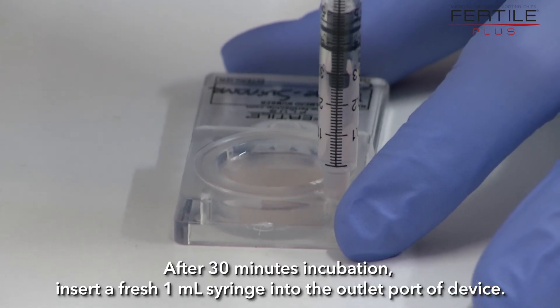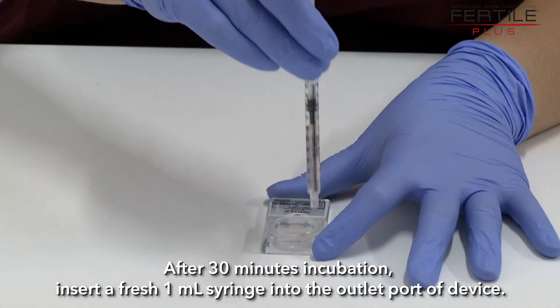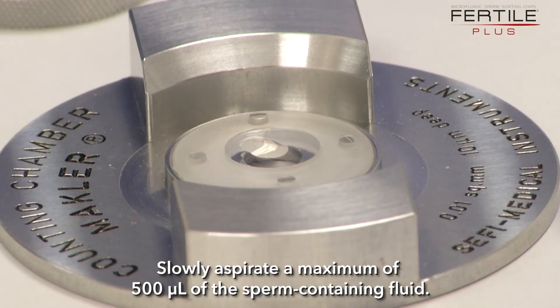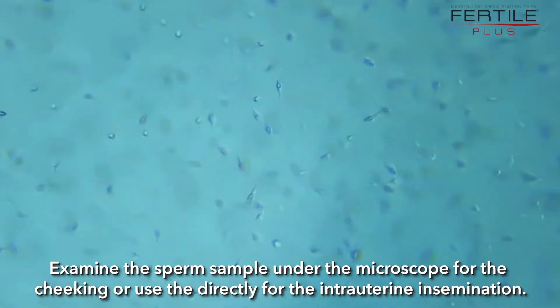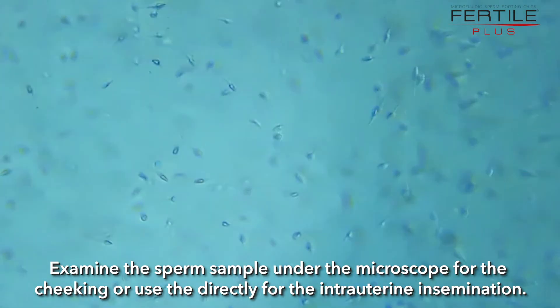After 30 minutes of incubation, insert a fresh 1 mL syringe into the outlet port of the device. Slowly aspirate a maximum of 500 µL of the sperm-containing fluid. Examine the sperm sample under the microscope for quality checking, or use the sample directly for intrauterine insemination.